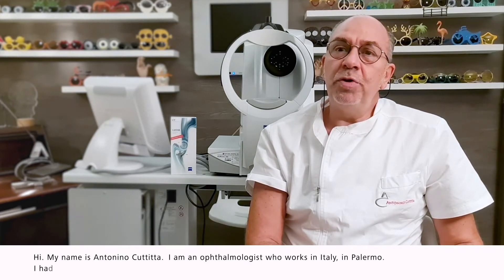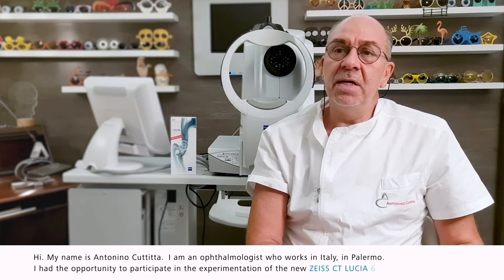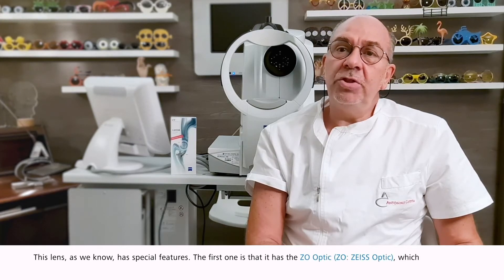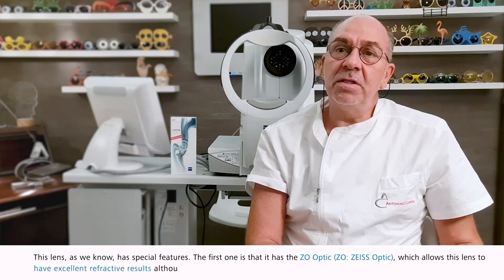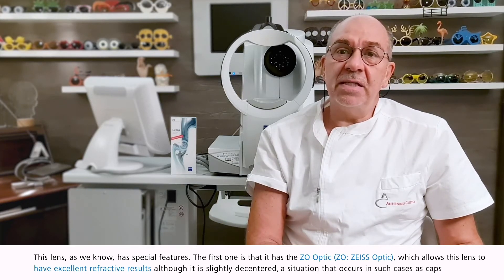I had the opportunity to participate in the experimentation of the new Zeiss CT Lucia 621P. This lens has special features. The first one is the Z-O Optics, which allows this lens to have excellent refractive results although slightly decentralised — a situation that occurs in such cases as capsulophimosis or exfoliation syndrome.